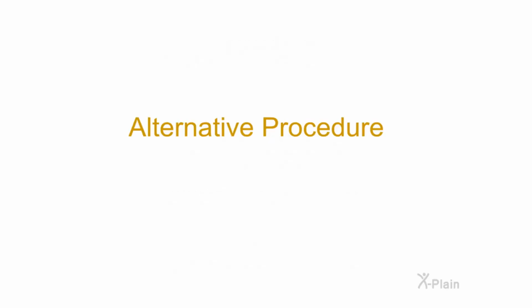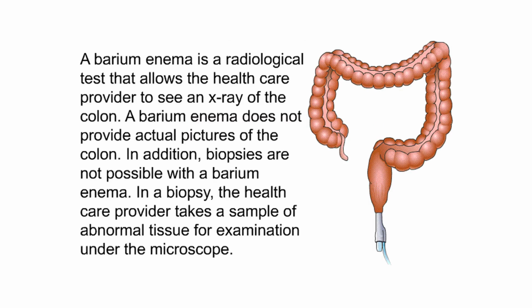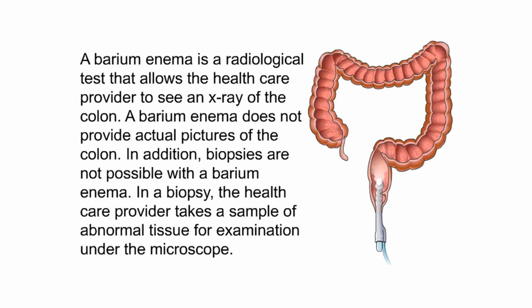Alternative procedure. A barium enema is a radiological test that allows the healthcare provider to see an X-ray of the colon. A barium enema does not provide actual pictures of the colon. In addition, biopsies are not possible with a barium enema. In a biopsy, the healthcare provider takes a sample of abnormal tissue for examination under the microscope.